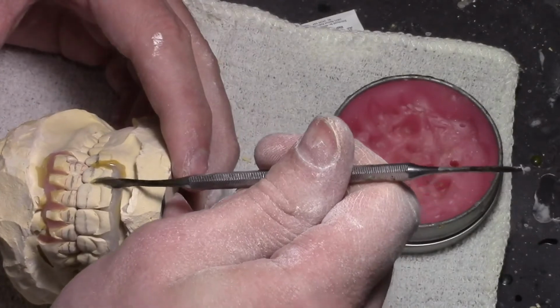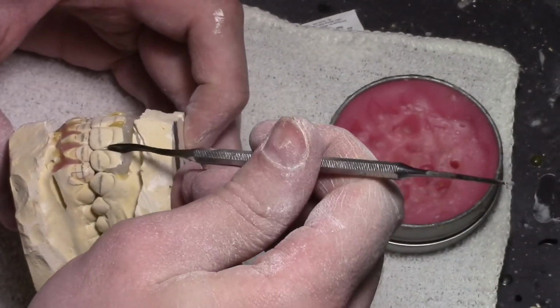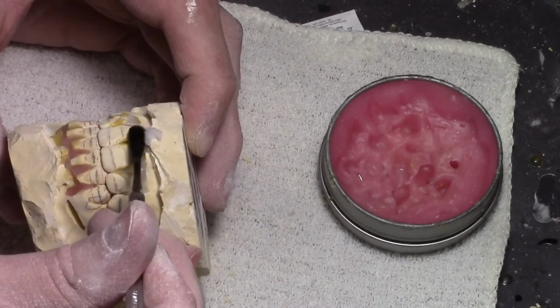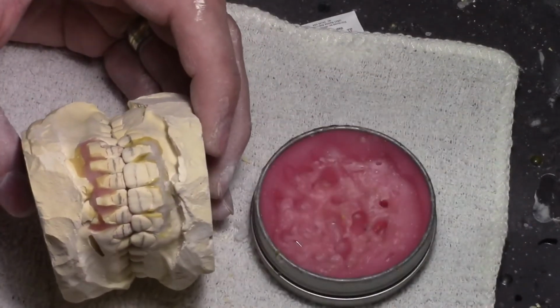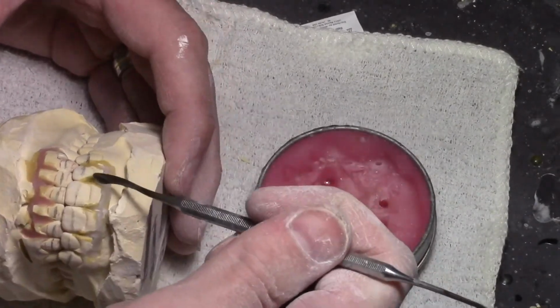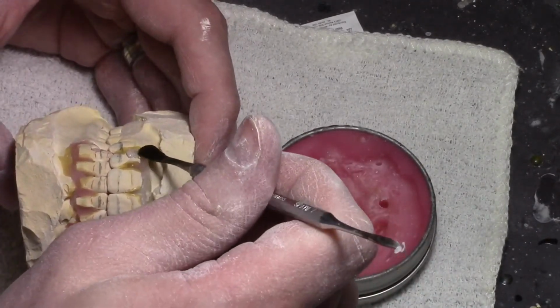I usually get my instrument really hot. Again, I want to warm up in between the teeth. If you get too much, just scrape it out. Now, some people will use Zap It. I think I have a video on that. You could look for Z-Base or Zap It videos. You'll probably find mine. This is the part where I'll put some Zap It in between the teeth.